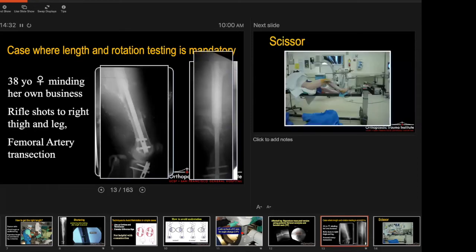This patient went to the operating room. She also had a femoral artery transection which had to be redone, and she was shot through the tibia as well. We put the nail in and the question is how do we get length, alignment, and rotation. You can see how much bone loss there is because of the debridement. This is exactly the patient where you have to follow all those guidelines. Keep in mind that trauma surgeons used to get sued most commonly for femoral rotation malalignment — today it's more missed compartment syndrome, but that was the most common thing.